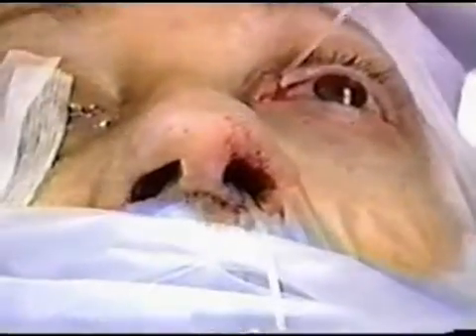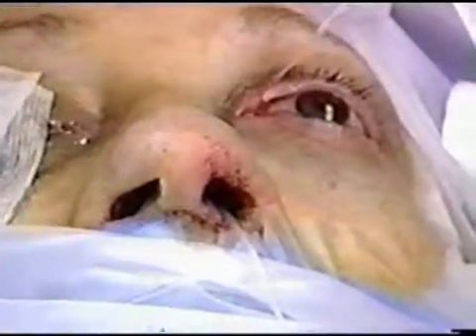This pulls the very large diameter end of the stent up the nose and into the balloon DCR ostium and lacrimal sac.